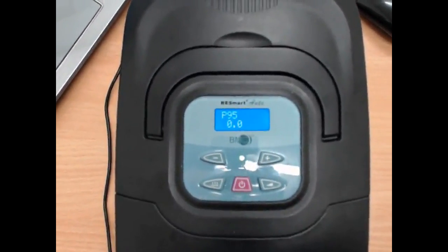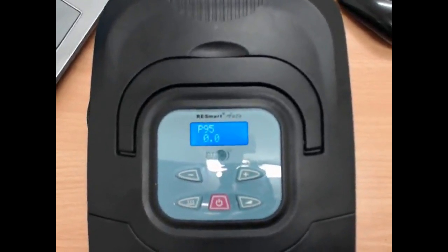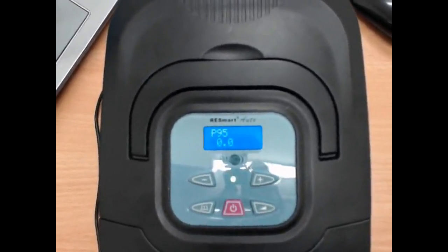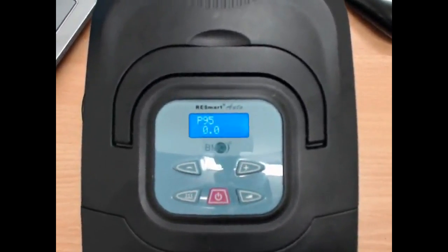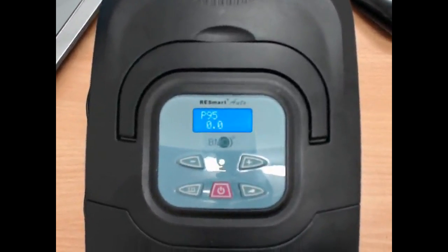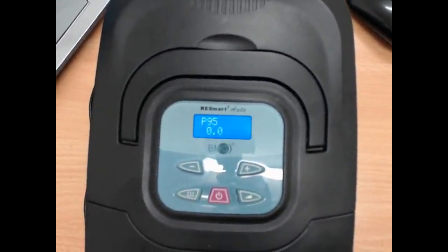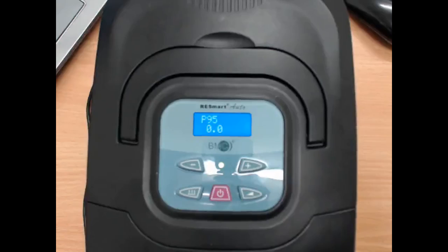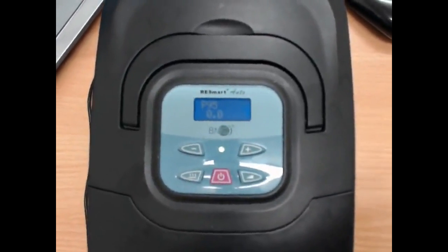Now the P95 is useful because it gives us an idea as to where the pressure is below 95% of the night. So if this P95 is, say, 10, it means that the machine is running below 10 centimeters of pressure for 95% of the night. It gives us an idea as to where we need to be if we want to fix the pressure. Right, so we want to be below that level.